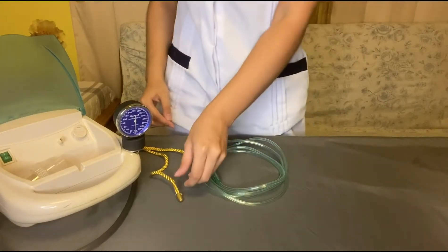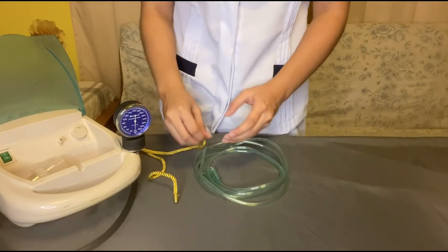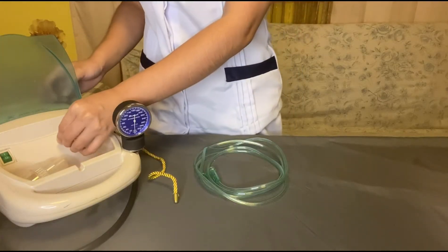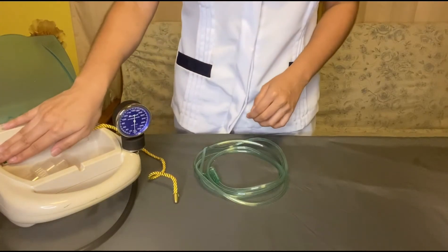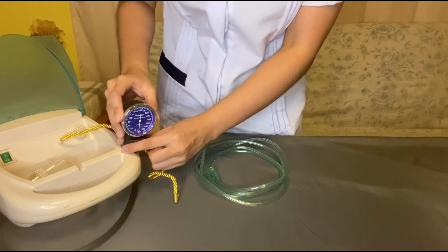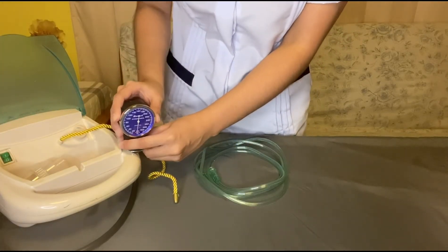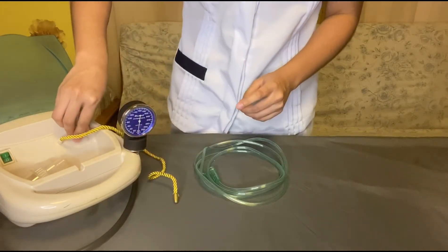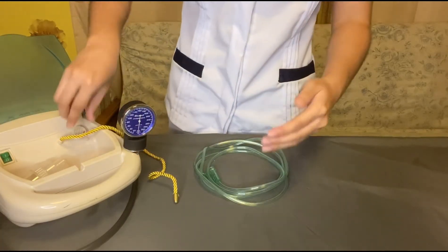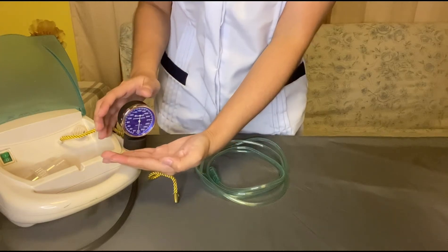First, connect the mains. Then switch on the unit and identify the pressure gauge. Occlude the distal end to check the pressure reading, and adjust the pressure knob to keep the suction pressure in the range of 80 to 100 mmHg.